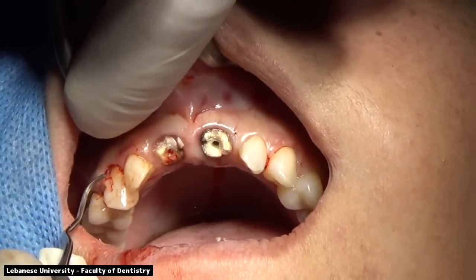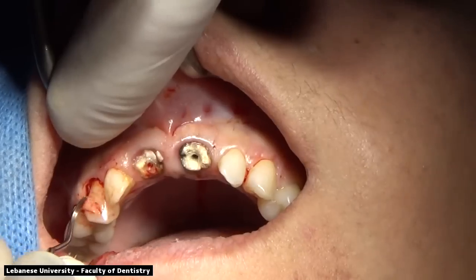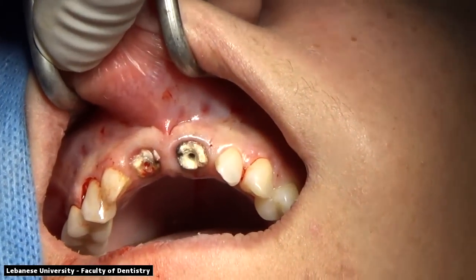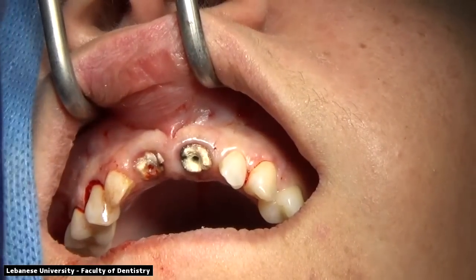So we're using a surgical curette to remove this band of tissue that we just excised. And you can visualize now that the canine appears as a better size and a better aesthetic shape of this tooth as well.